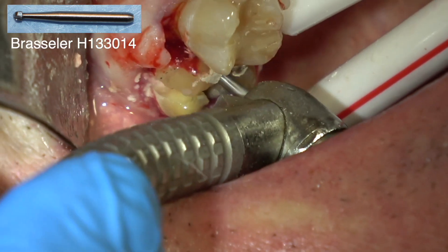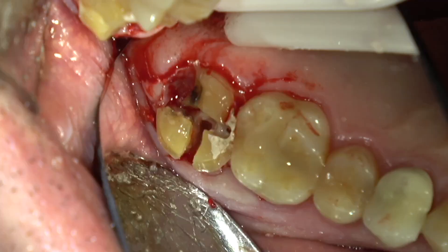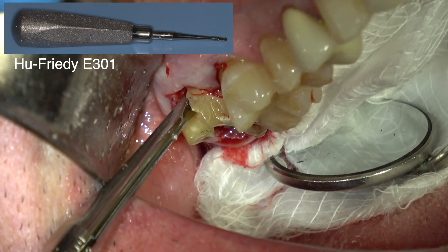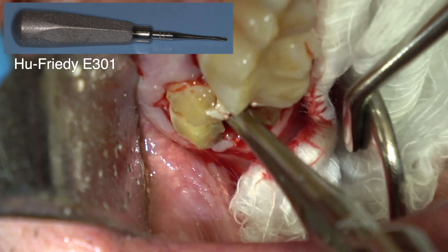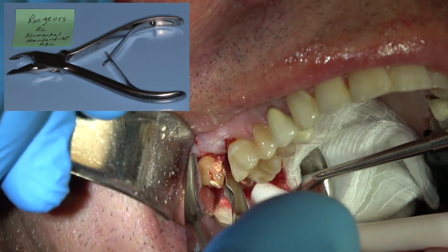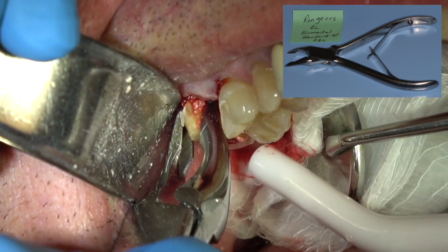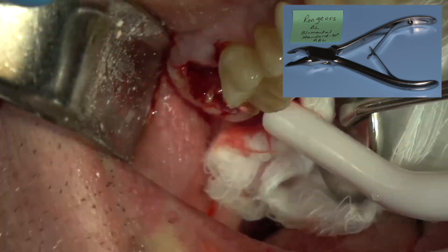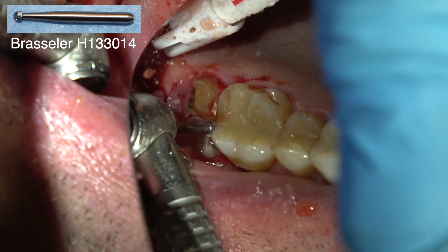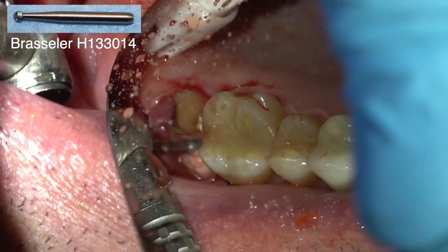All these roots are going to be brittle, but the buccal roots will be the most brittle and there's a very good chance you'll fracture off the coronal part of that segment even trying to be very careful. This is just a small elevator — I'm just moving the pieces. Here comes the mesial buccal root, and there's the distal buccal root. I'm trying to just unscrew them after I've luxated them a little bit. You can see I've still got the palatal root and this is the section of the mesial buccal root remaining — the coronal part has been extracted.